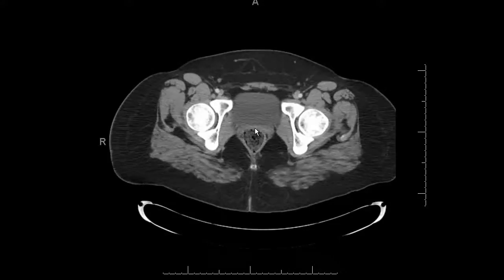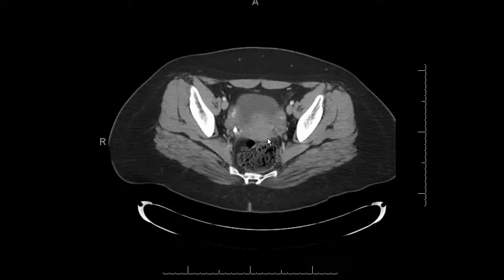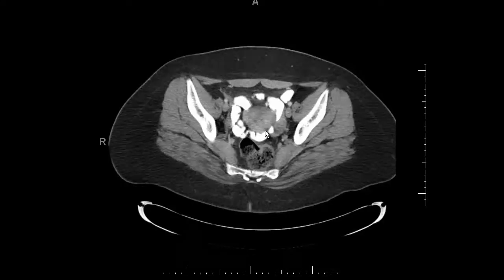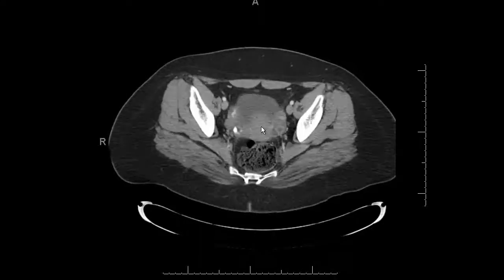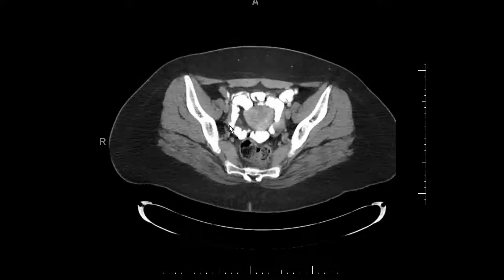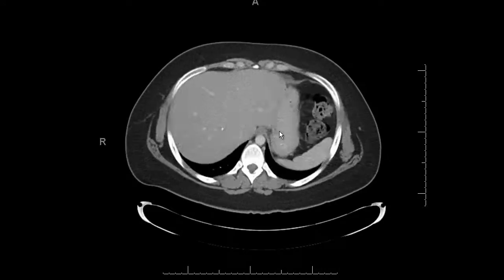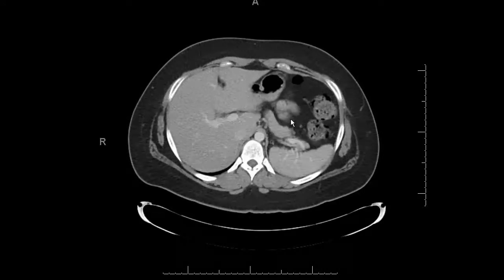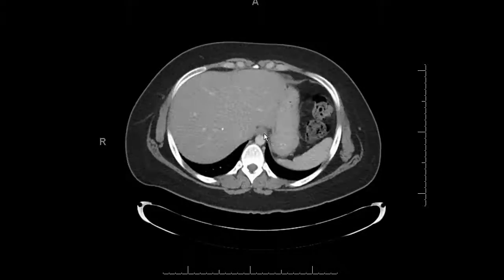In this female patient, I look at the uterus — as you come up, you start to see the body of the uterus. Follow it up, and here's the left ovary, and here's the right ovary.